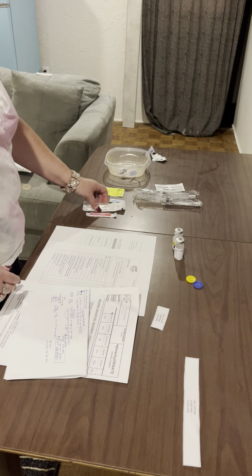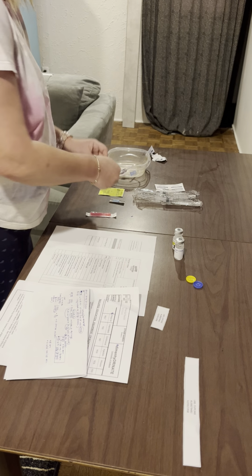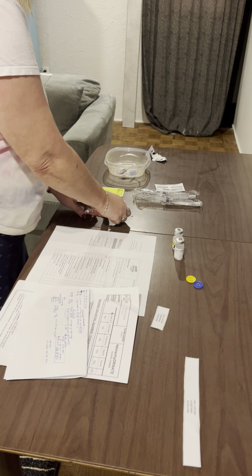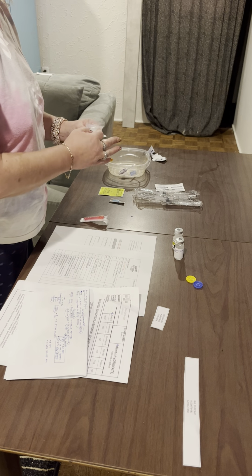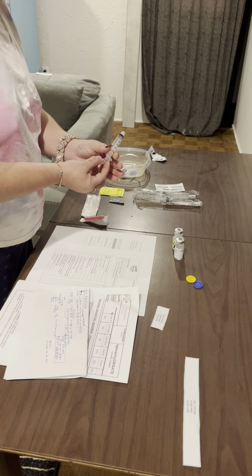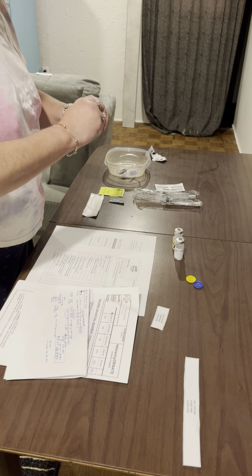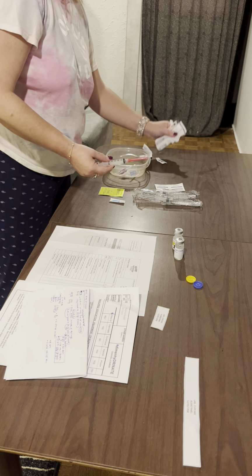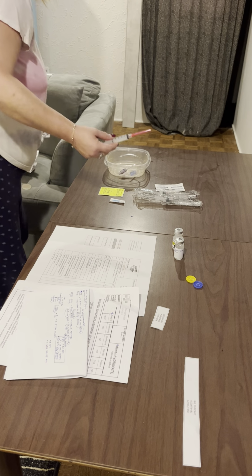Okay, so the next thing we're going to do is some more hand hygiene. Okay, and we're going to open our syringe here. We're also going to open up our blunt needle as well. Again, maintaining sterility. Okay, so those are both open, not touched. So obviously we are going to take our syringe out of the package, and we're just going to connect it to the blunt filled needle. Okay, so we can get rid of our garbage here.